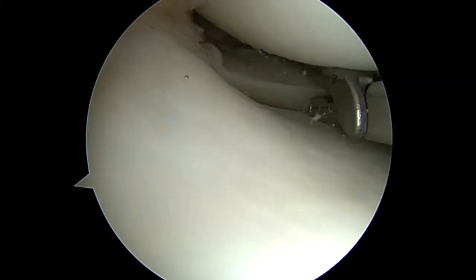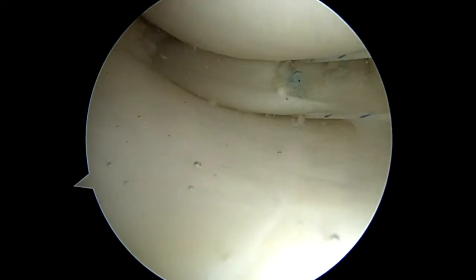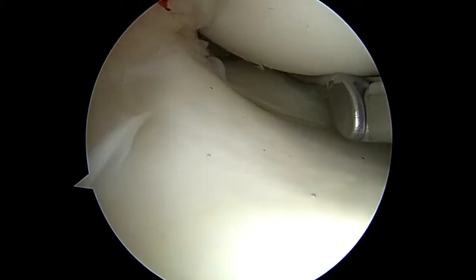The device is placed into the posterior compartment of the knee, and you don't need to see back there. The first stitch will go behind the meniscus, and then the other limb of the stitch will be placed more centrally.